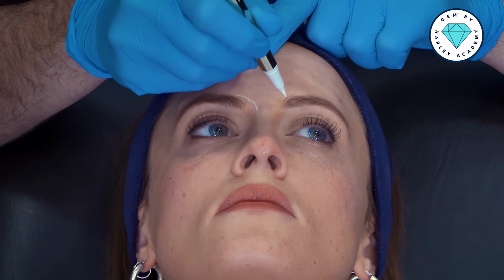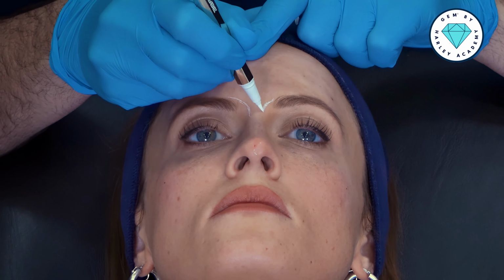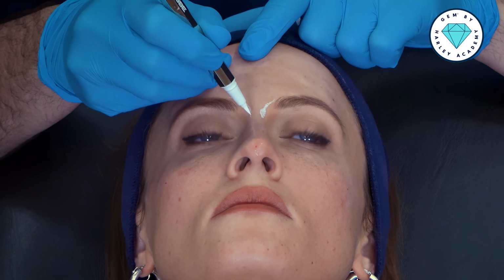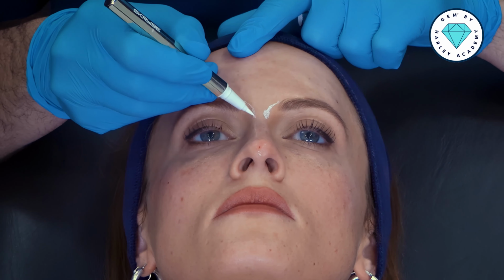And then, as with the forehead, assessing the nose from the top of the bed is often the best way to do it. So if you just raise your chin for me, head up. What I want to draw on here are some of these aesthetic lines. So we have these very beautiful lines extending from the eyebrows down to the dorsum of the nose. And any break to these lines is quite obvious.